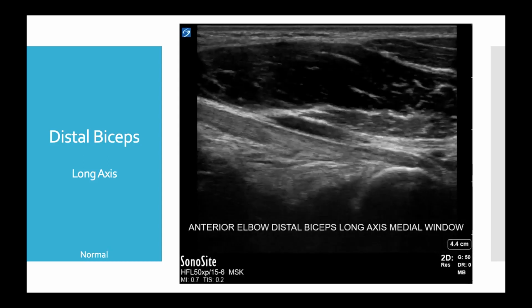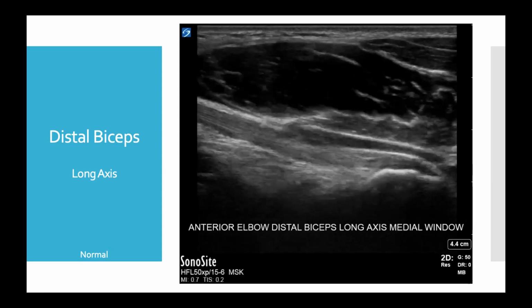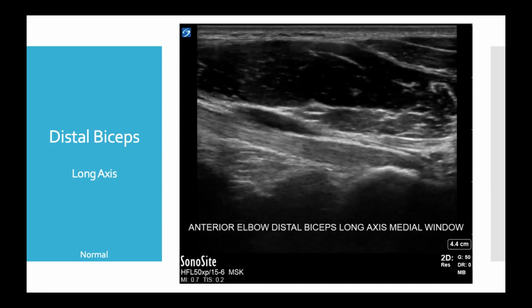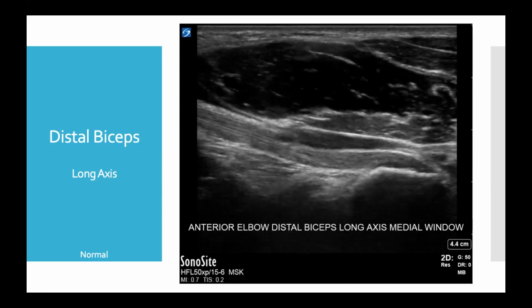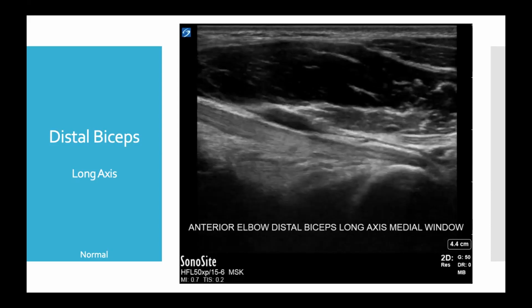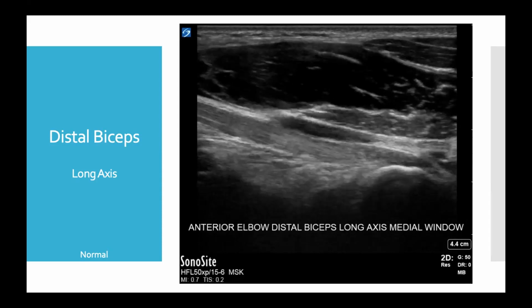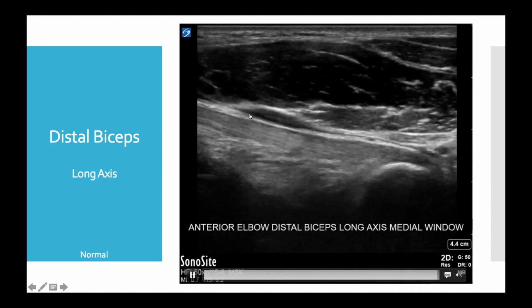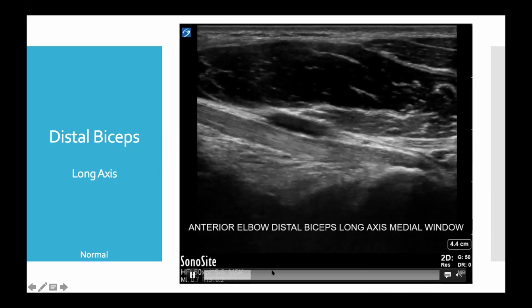And this can, A, help us identify what we're looking for, but B, help us identify maybe some occult partial tears or things like that. And it also can clear up some anisotropy if we're looking at that at the insertion site. But here we can also see the brachial artery passing back and forth as it pulsates and providing us with a good acoustic window.